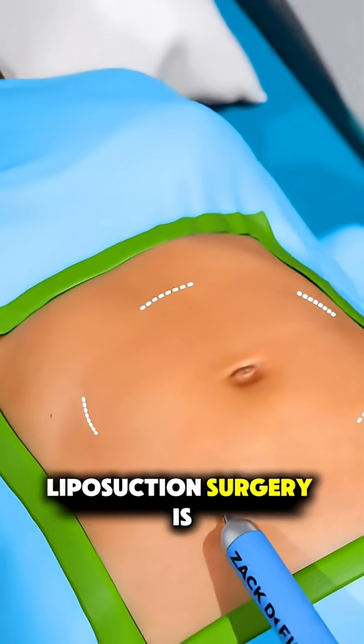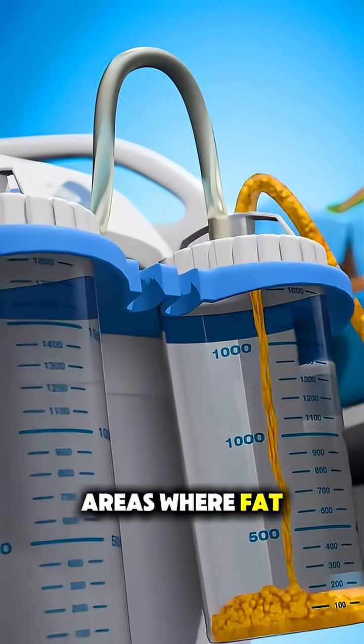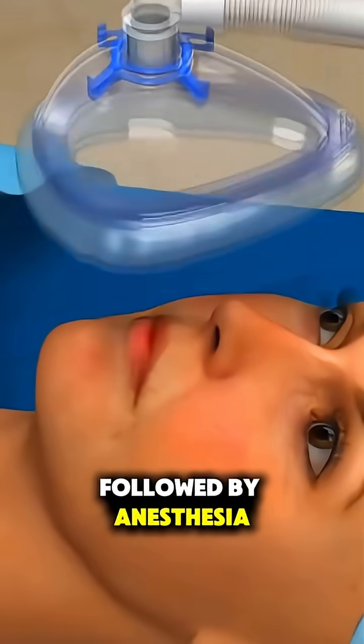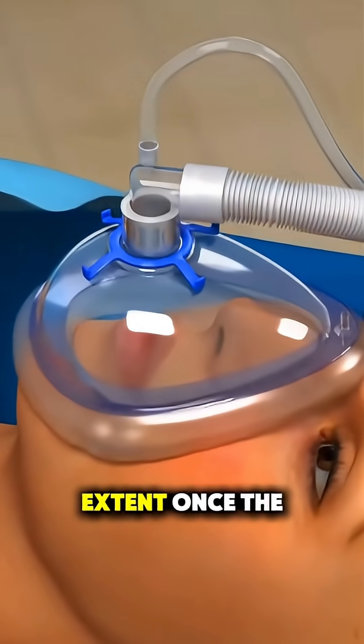Ever wondered how liposuction surgery is done? It all starts with the patient being marked for areas where fat will be removed, followed by anesthesia to ensure comfort — either local, regional, or general, depending on the extent.